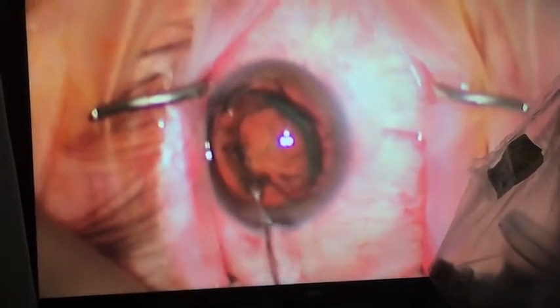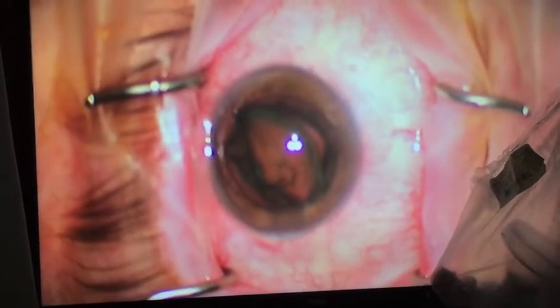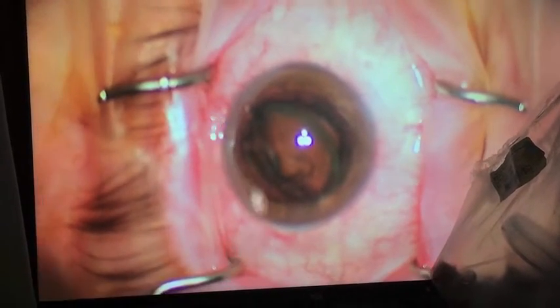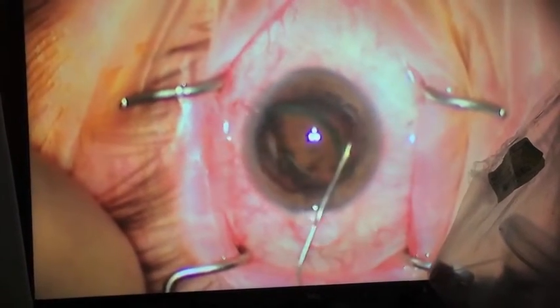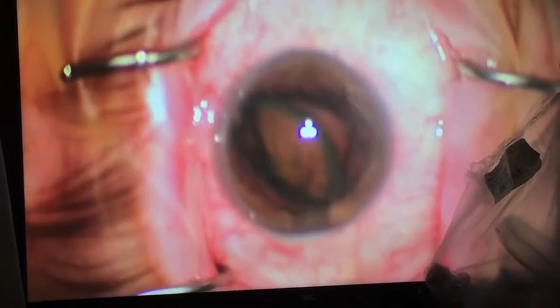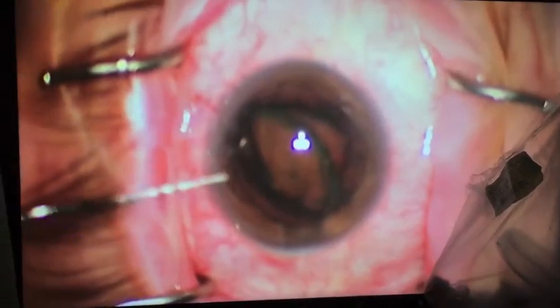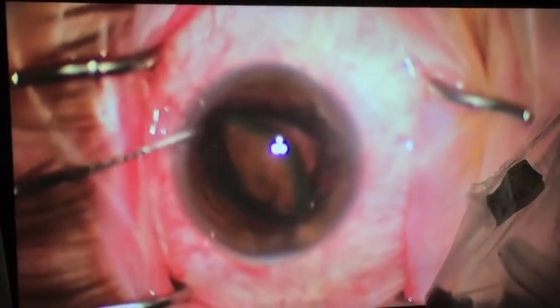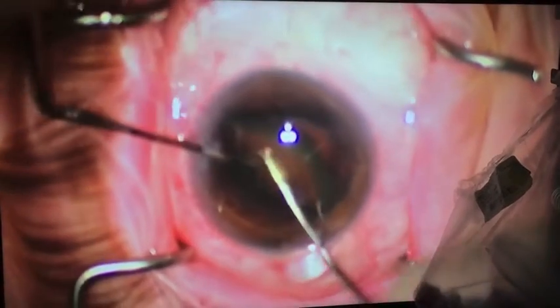Now I'm flipping the cataract on its side so I can use two instruments to gently disassemble the patient's cataract. These two instruments are the Toyos chopper and a Becker.